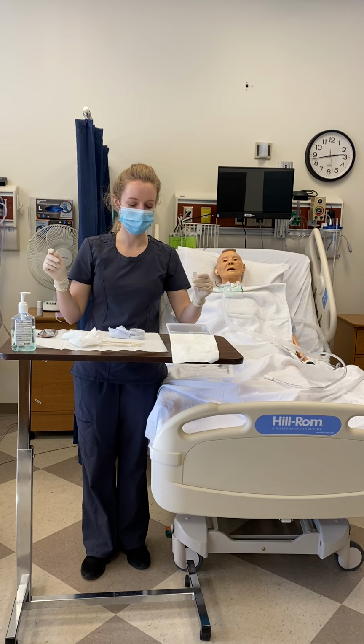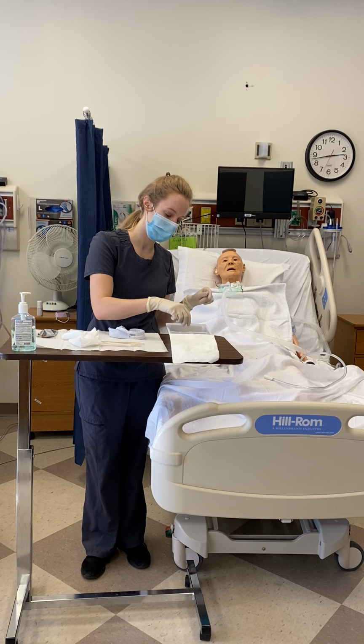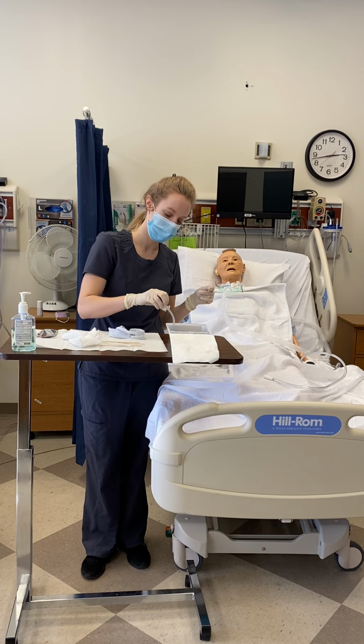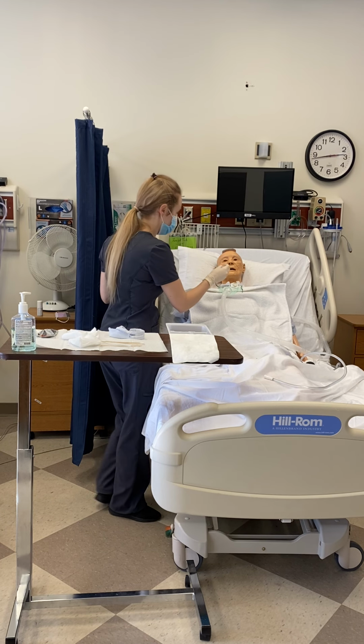And then once I have scrubbed it with the saline and peroxide, I drop it into just plain saline to rinse. And at this point, it's considered sterile, so I do take it out and tap the saline out with my sterile hand before reinserting.